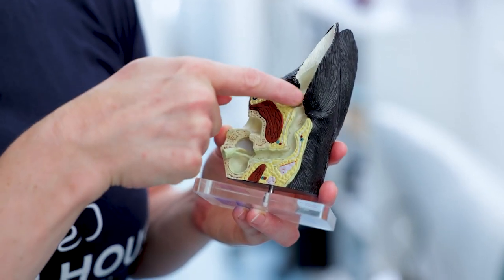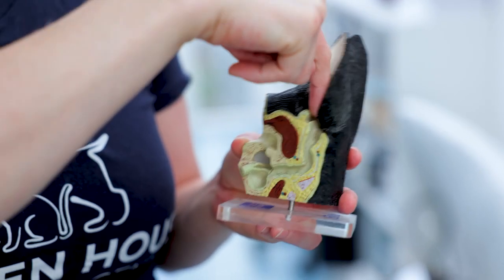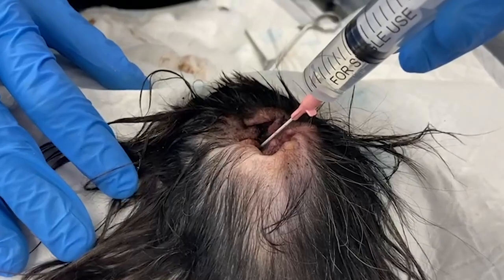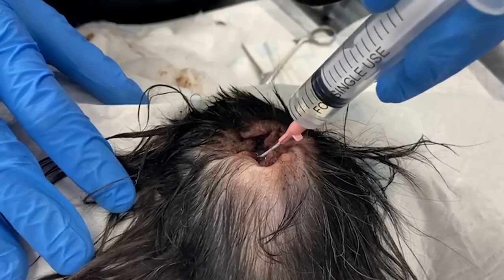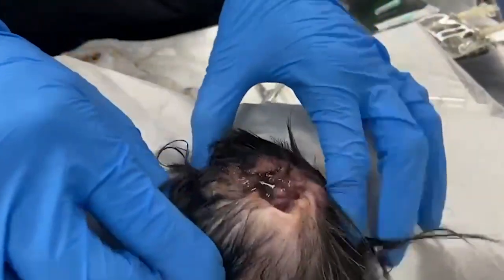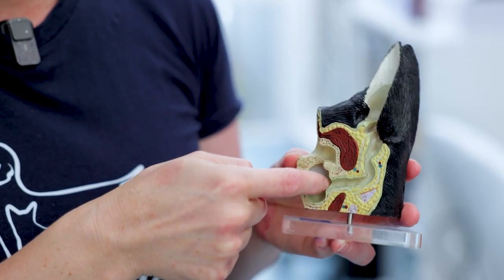The issue with the ear canal is that it's very long and comes at an angle, so when you clean the ears you only clean partway in. When we do cleaning under sedation we get a bit further — we can squirt some saline and do a slightly better wash, but again we only reach so far. With the otoscope we go all the way and we can see up to the tympanic membrane.